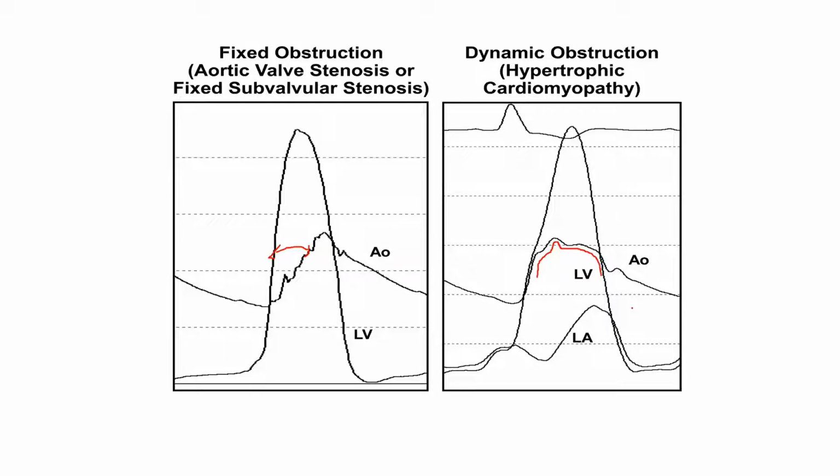Good. So if you have a pulse that looks like a spike and dome, and there is no delayed upstroke between the aortic pulse and the LV, this is more of HOCM. Because in aortic stenosis, when it is severe, you get this tardus, delayed upstroke of the aortic pulse. And you see the upstroke is kind of what?